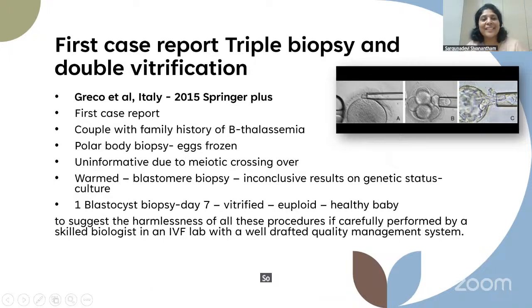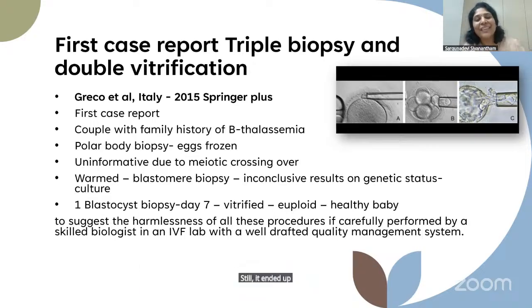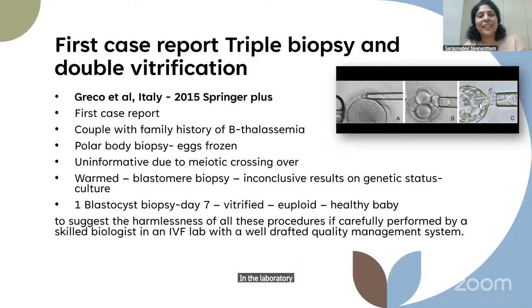So this is one of the reports from 2015 where they just went on with these manipulations for an embryo. Still, it ended up with a healthy baby. They were suggesting the harmlessness of all these procedures if carefully performed in the laboratory.